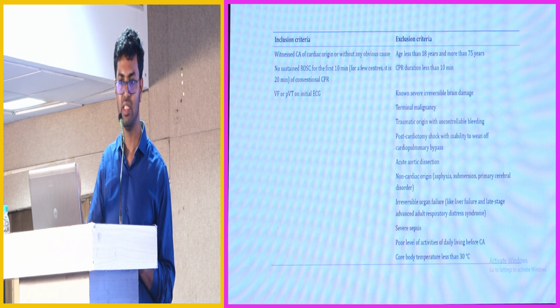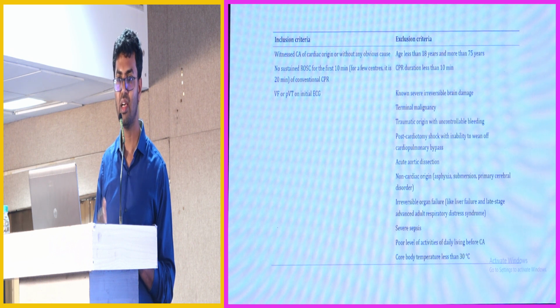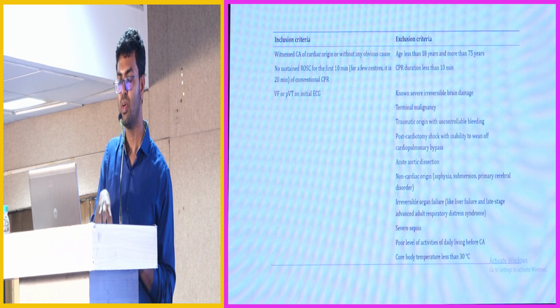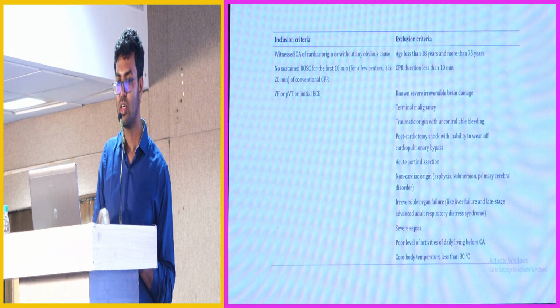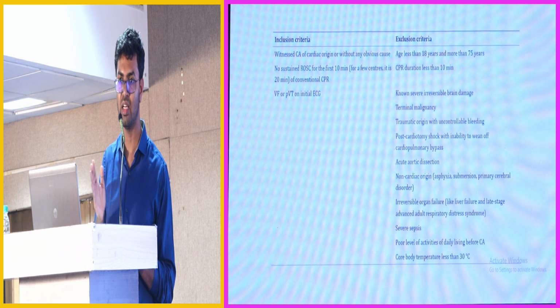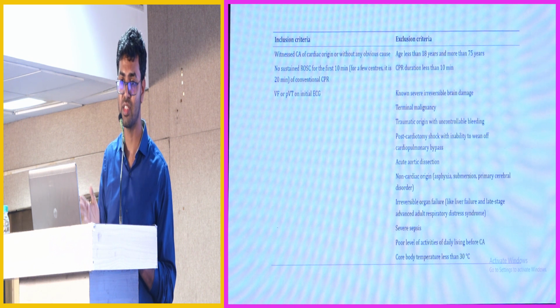They immediately did CPR and started VA ECMO, and brought the patient to the hospital. And I was in the cath lab. The thing was, she was only 36 years old. They thought it could be a coronary event, because 2 days before that she had no symptoms. Within 2 days she had fever, then heart function came down, and then she underwent ECPR.